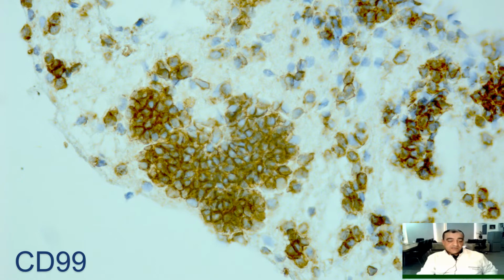First-line immunohistochemistry shows that the tumor cells have very nice and intense membranous staining of CD99. At this point, a pathologist thinks about the possibility of Ewing sarcoma, because CD99 gives characteristic intensive membranous staining in Ewing sarcoma, although it is completely non-specific.